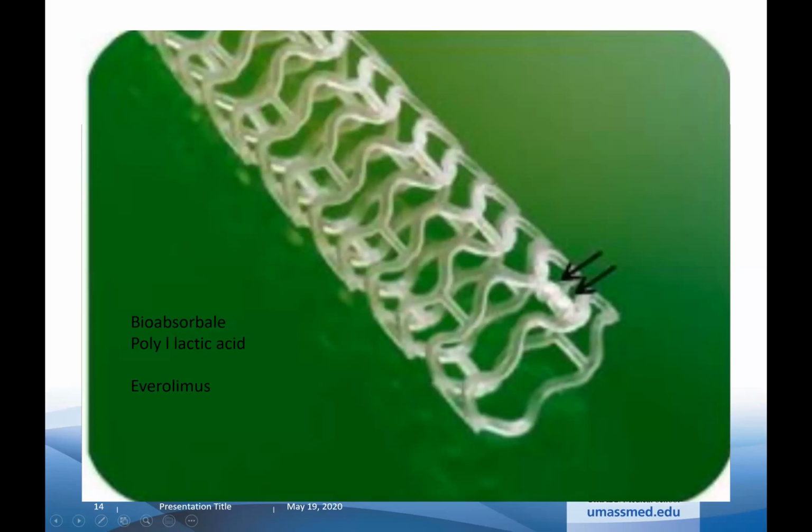Okay, so I was talking about this bioabsorbable stent. This is a stent made up of poly-L-lactic acid. So what's the good thing about lactic acid? It gets metabolized in the body, and it has drug impregnated on the polymer.